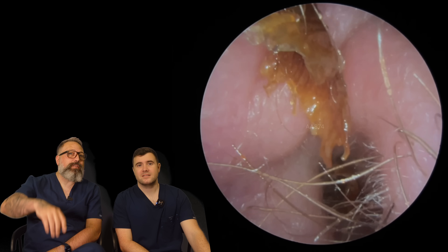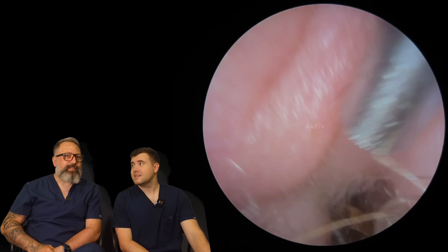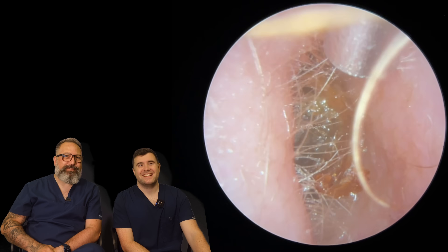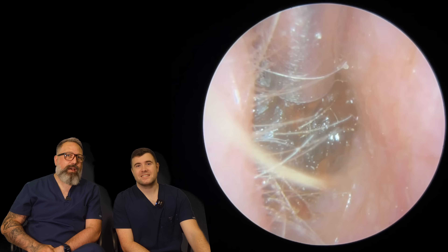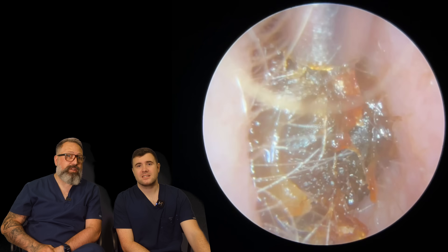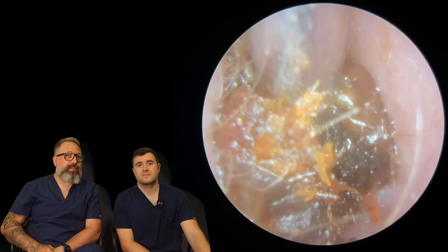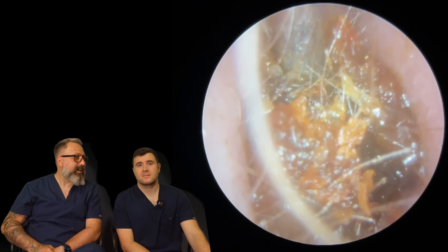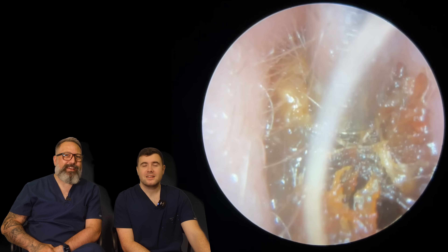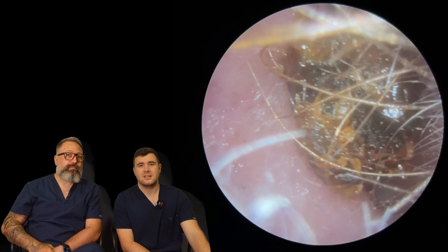Look at that bad boy! We said about a ribbon the other day and it all broke away — this was the ribbon. Yeah, I just remember, this is the one. So it was a long kind of ribbon. Basically this lovely gent had been away on holiday. He was trying to keep his ears nice and dry, normally puts ear plugs in, and then fell into the sea and got water in his ear and it moved all the wax around. But it's come away nicely though. Always nice to see when you see them all coming away in big pieces.